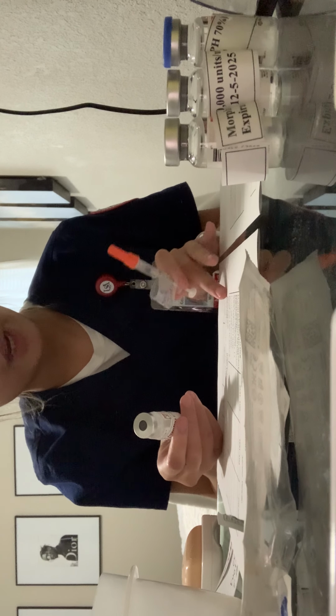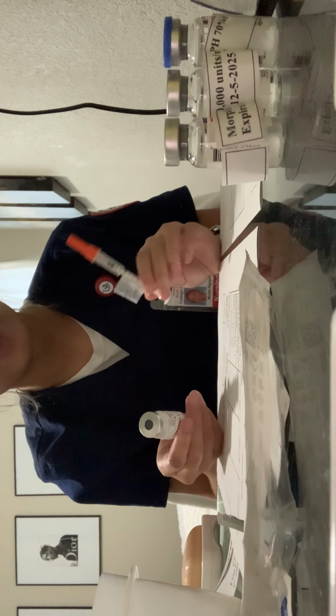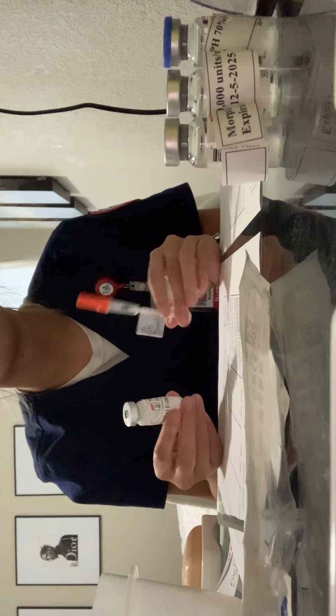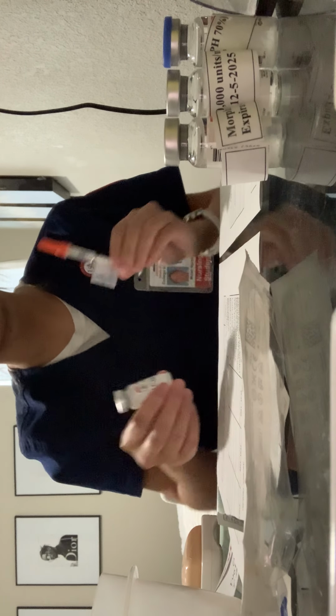Date of birth 08/25/1963, medical record number 417-6352. And the right documentation will be done after the medicine is administered, and the right indication is diabetes. So now I'm going to take my vial, syringe, and MAR, and I'm going to go into my patient's room.